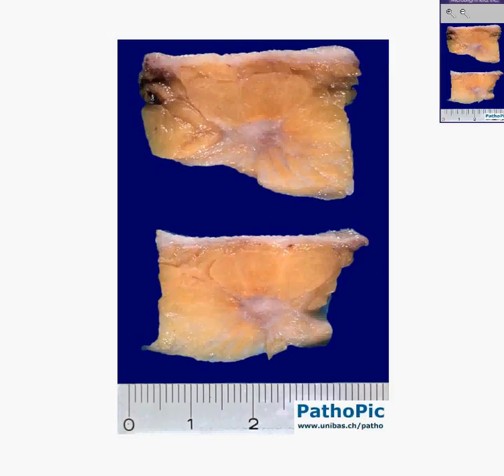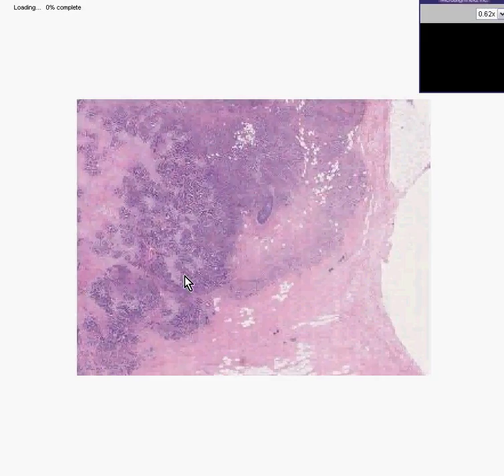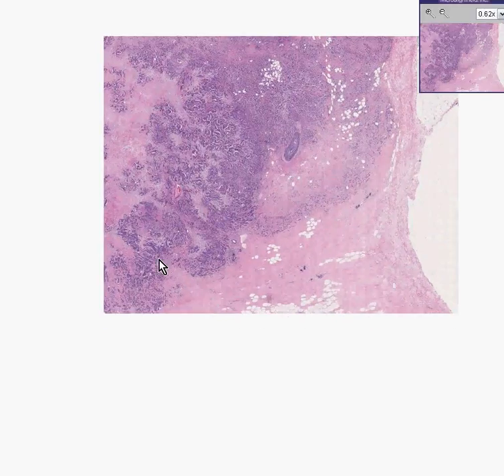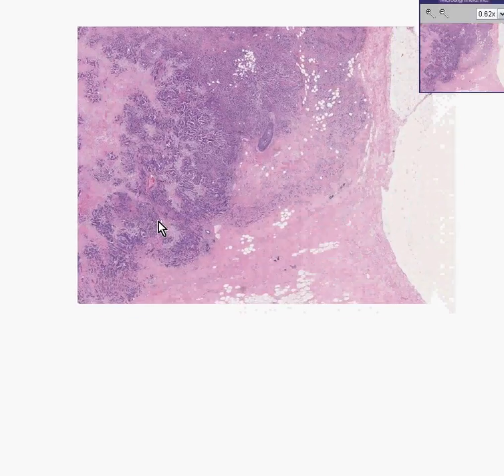It infiltrates. And even microscopically, you can tell that cancers are tumors that are not confined within capsules. They send these little infiltrating nests out into the fibrous tissue.